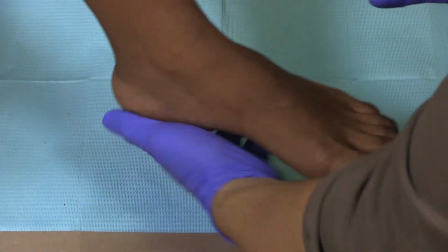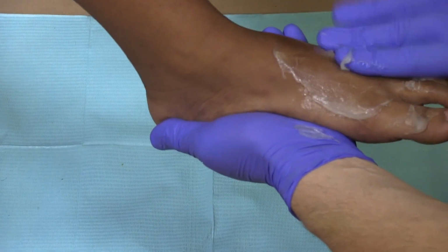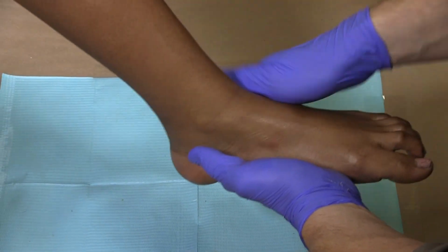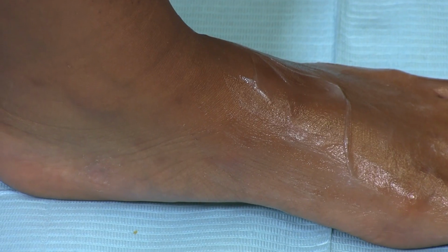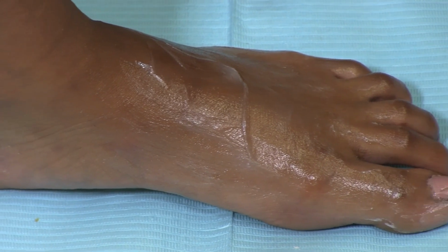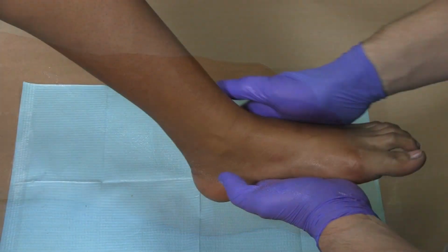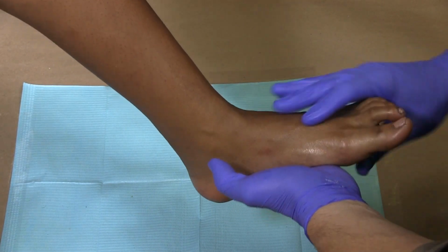Apply a thin layer of Vaseline to the customer. This is important as the Vaseline acts as a mold release after the impression has cured. Do not leave clumps of Vaseline or a thick layer, as this will destroy details in the mold. Paper towels may be used to remove excess Vaseline.